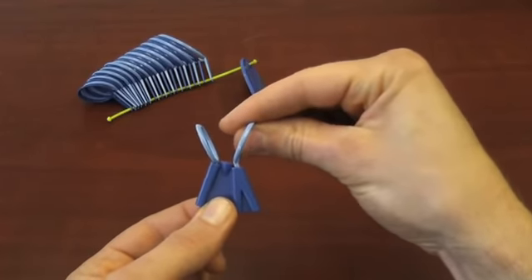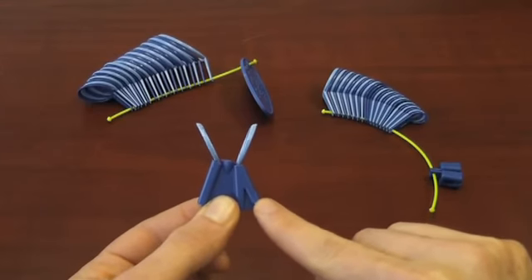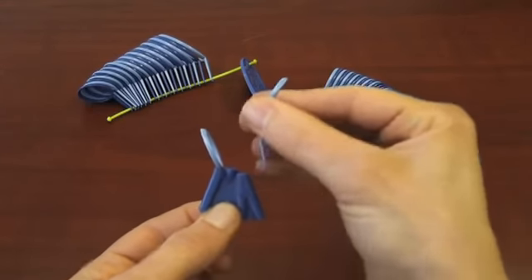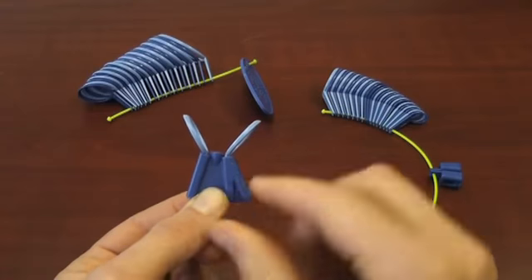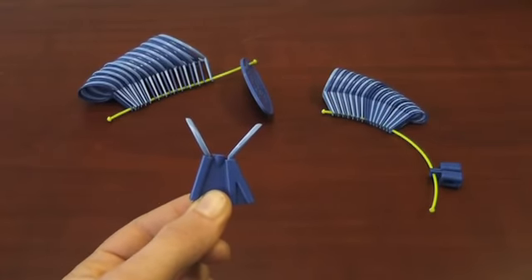When you need a less angled measurement, say for a DIP joint or joints with nodules, then use the 15-degree slot. When a longer splint is desired, for greater correctional force, use the 30-degree slot. You may need to play with which slot works best for each finger you measure.